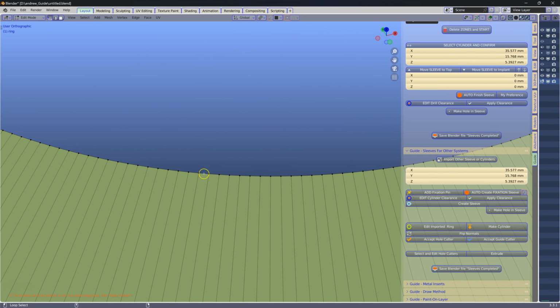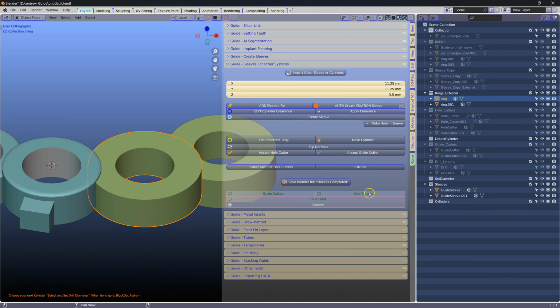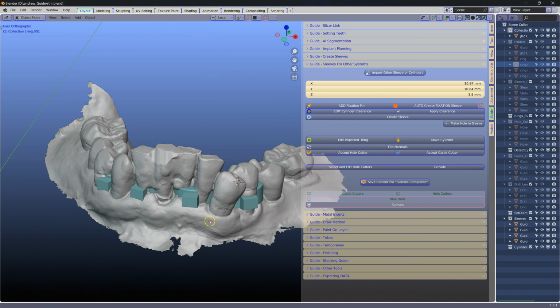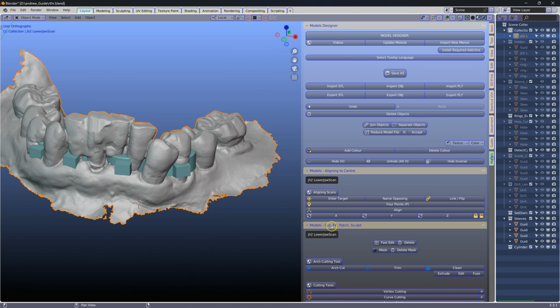Okay. Now these have all timing notches, but in this case I don't know what the timing of the rotations are. And then I'm going to just fast forward.